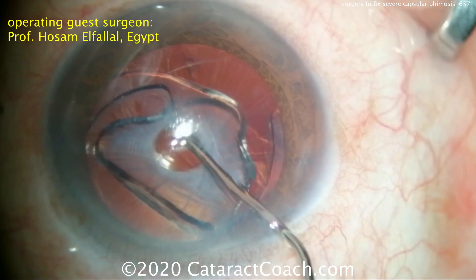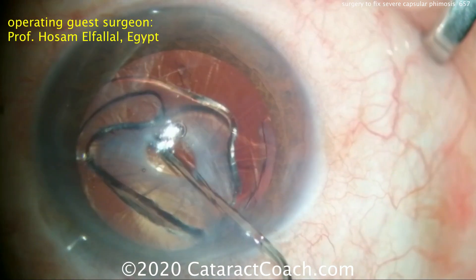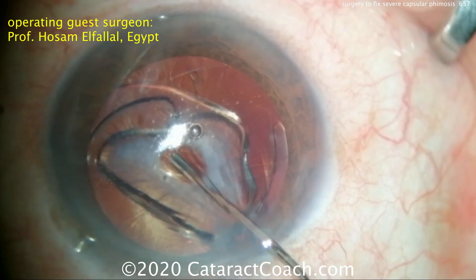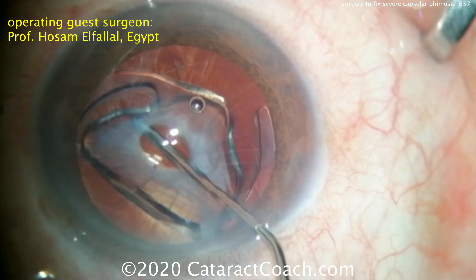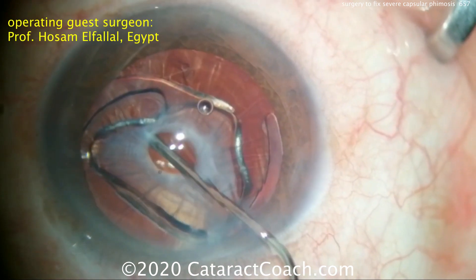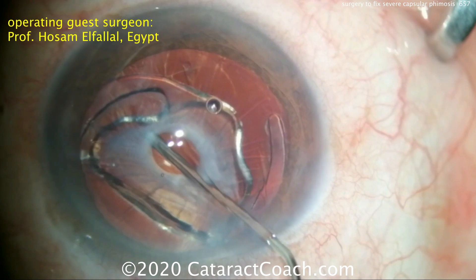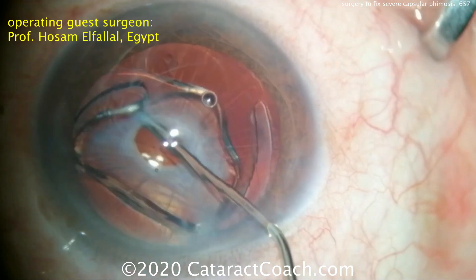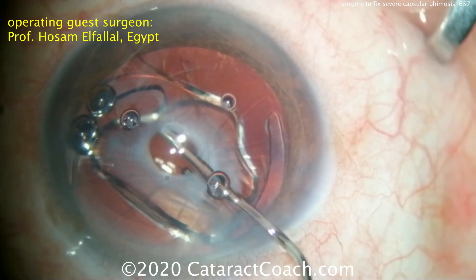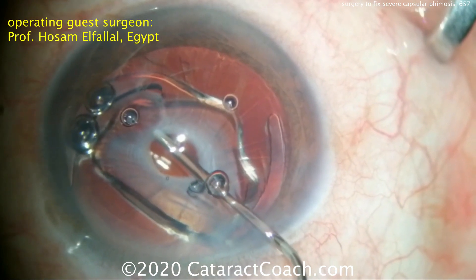The first step is via paracentesis, injecting viscoelastic to open up the capsular bag. It's a nice and slow technique — the goal is to increase the volume of the capsular bag. When you open up the capsular bag, the IOL optic can resume its normal shape. That small central circular opening is what's left of the capsular rhexis.